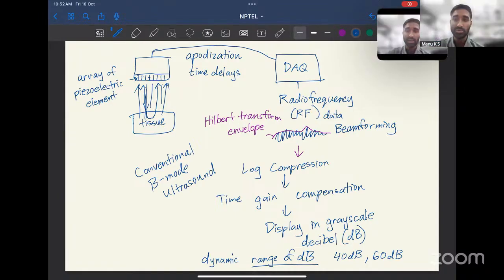Okay, let's say we want to detect the envelope. That's one simple step. I don't know if this is exactly how it's being done, but if you're from an electrical or electronics background, you learned about peak detection circuits using diodes and capacitors. So that's one way. If you have a varying signal, you can detect the peak.